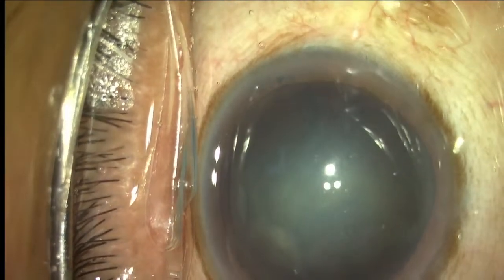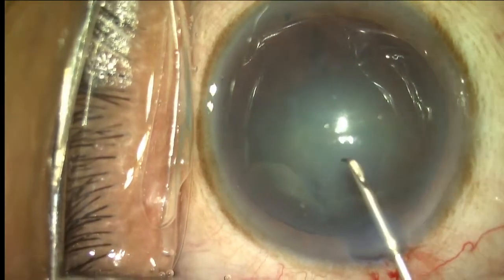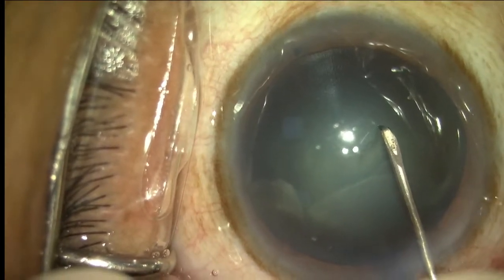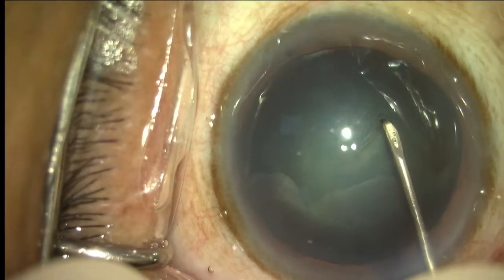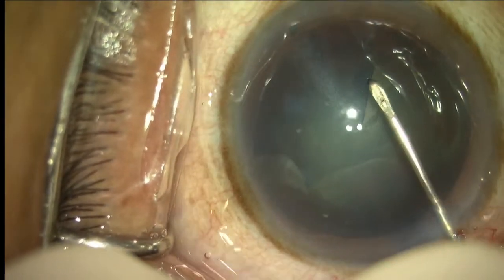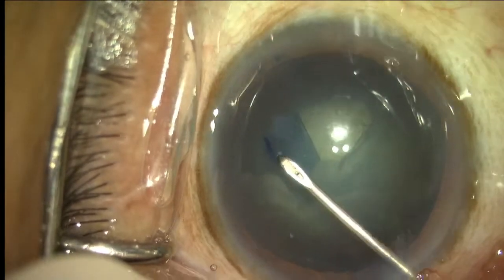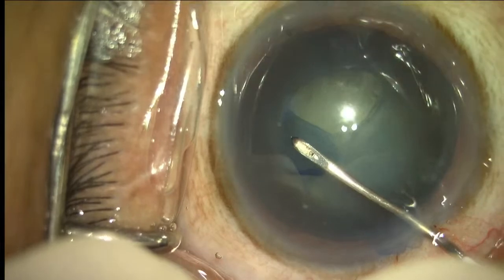So as with all the other lenses, centration of the rexis and a well-sized rexis is very important with this lens also. But fortunately, with this lens, a decentration of up to 0.7 millimeters is tolerated well. Nevertheless, it's always good to have a well-centered and well-sized rexis. So I'm aiming here at a rexis size of between 5 to 5.5 millimeters.